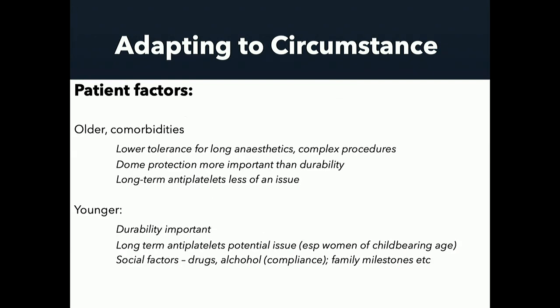What about the patient? Well, obviously in an older patient, patients with comorbidities, these guys will have a lower tolerance for anaesthetics and for complicated procedures. And often we're not so worried about durability in an older patient. We're more worried about protecting the dome of the aneurysm rather than getting a perfect angiographic result. And of course, in older patients with a limited lifespan, long-term antiplatelet use is less of an issue.